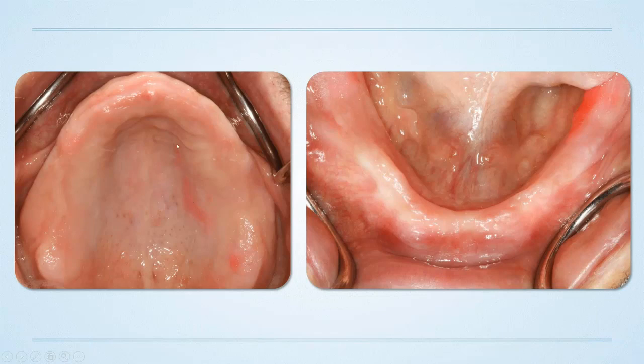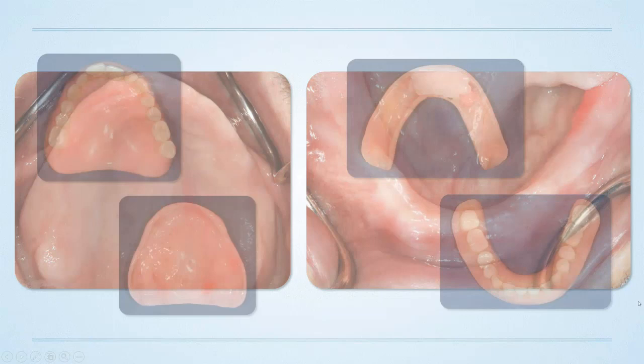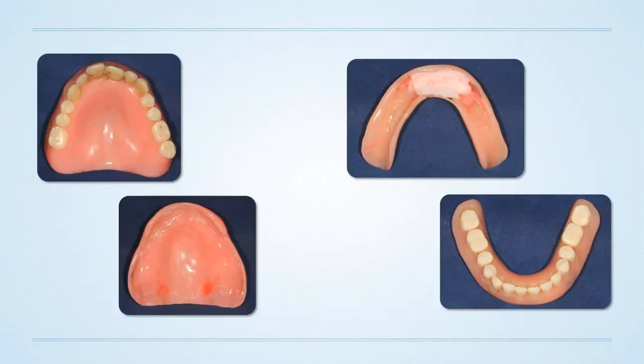We can see here that I see across the board these little pink areas sticking out here, here, and in here. And that's denture adhesive. Even though this patient came in with this limited problem, I asked them, okay, do me a favor, take out your upper and lower teeth. And he says, well, doc, here's the upper denture. Oh, that's all you need to do to fix this tooth. I'm like, yeah, no, not a problem. We'll be happy to fix that tooth. I'll get it fixed up for you in a jiff.